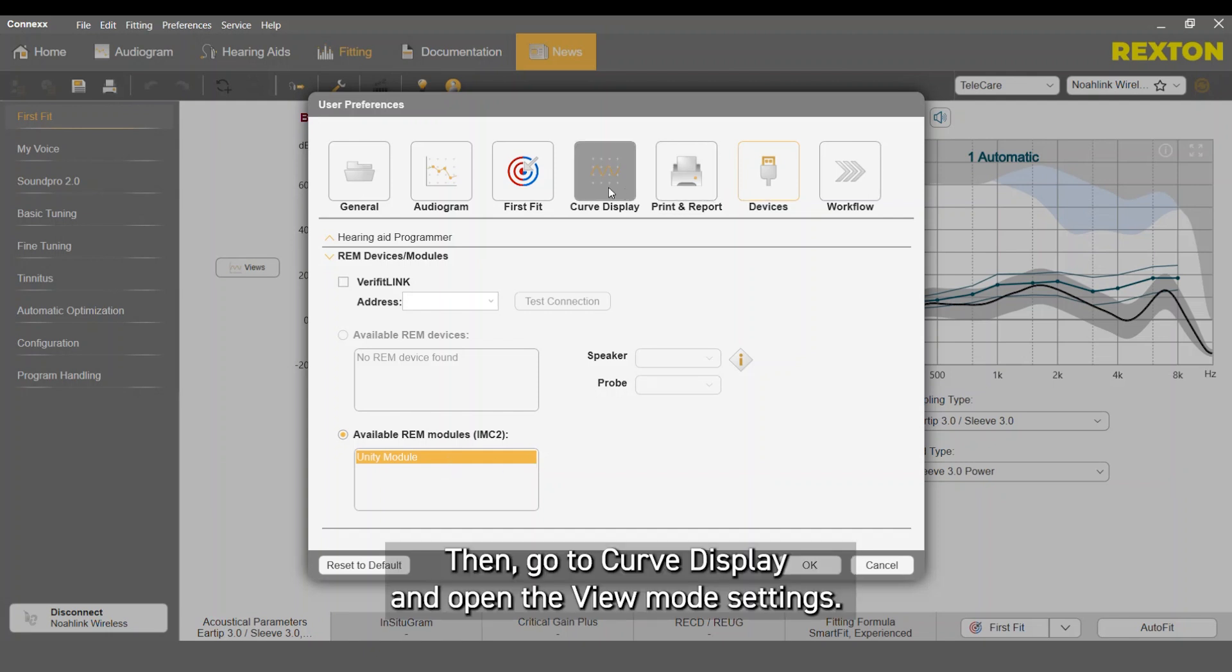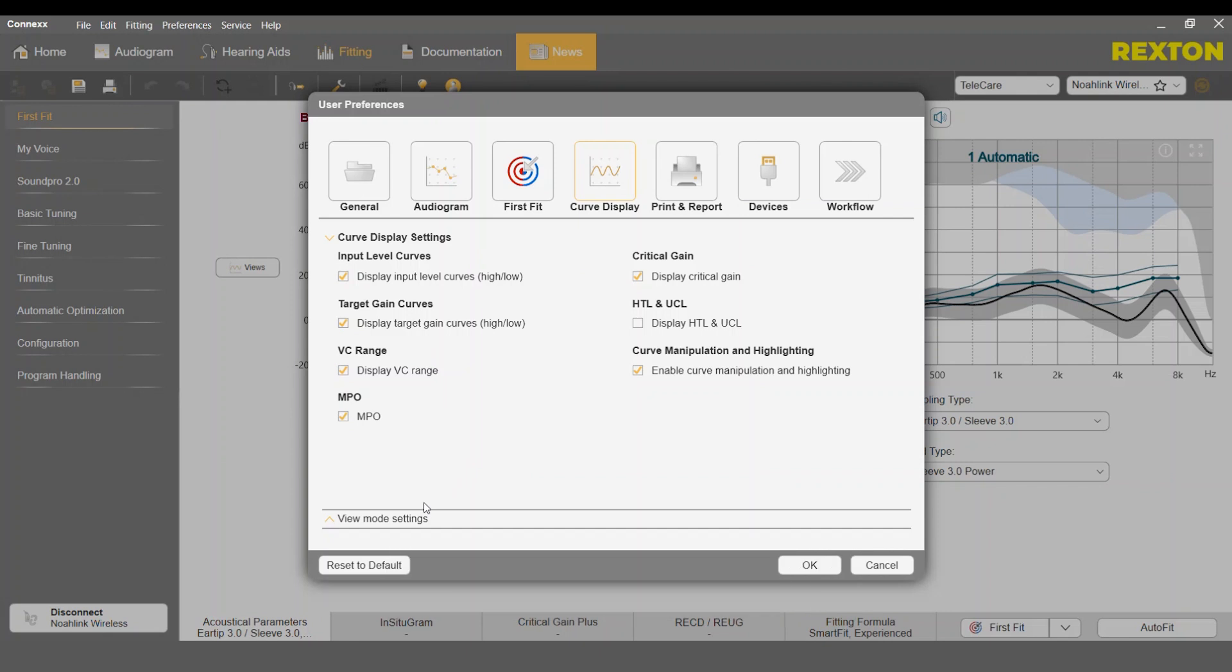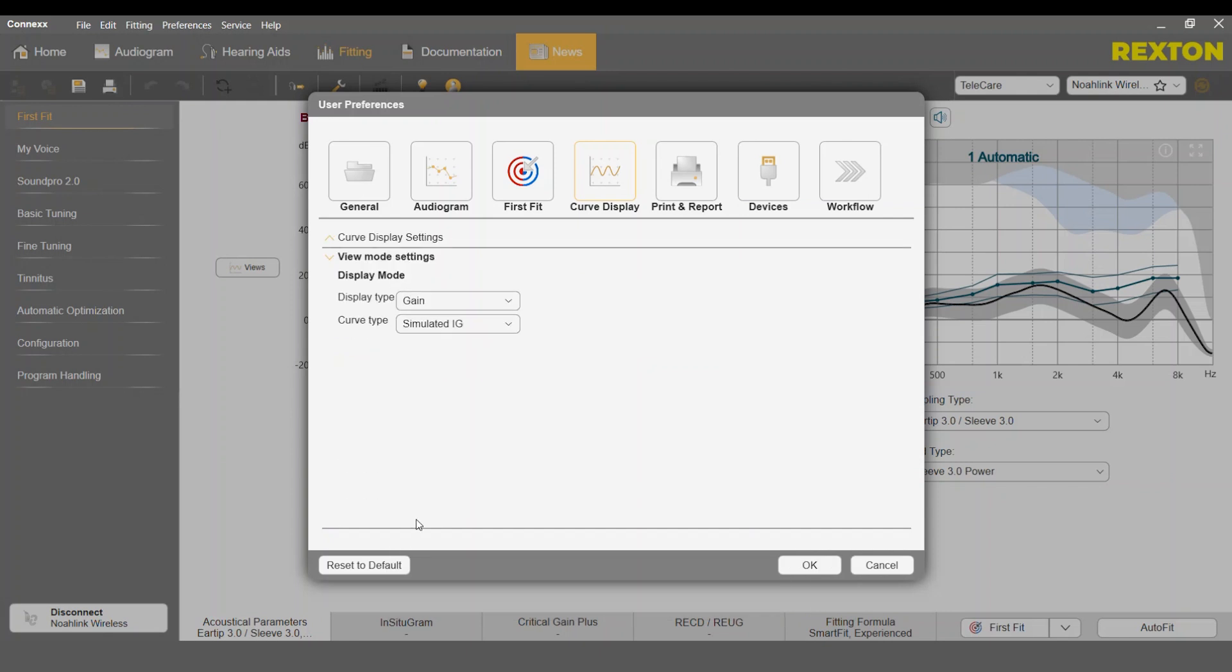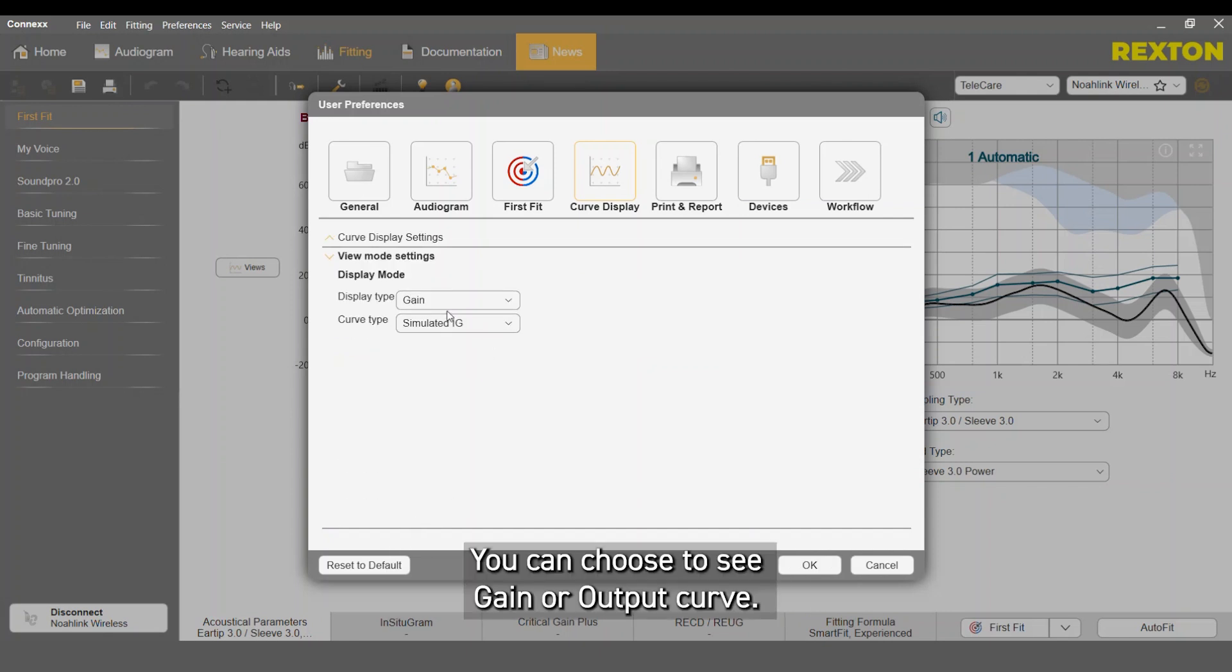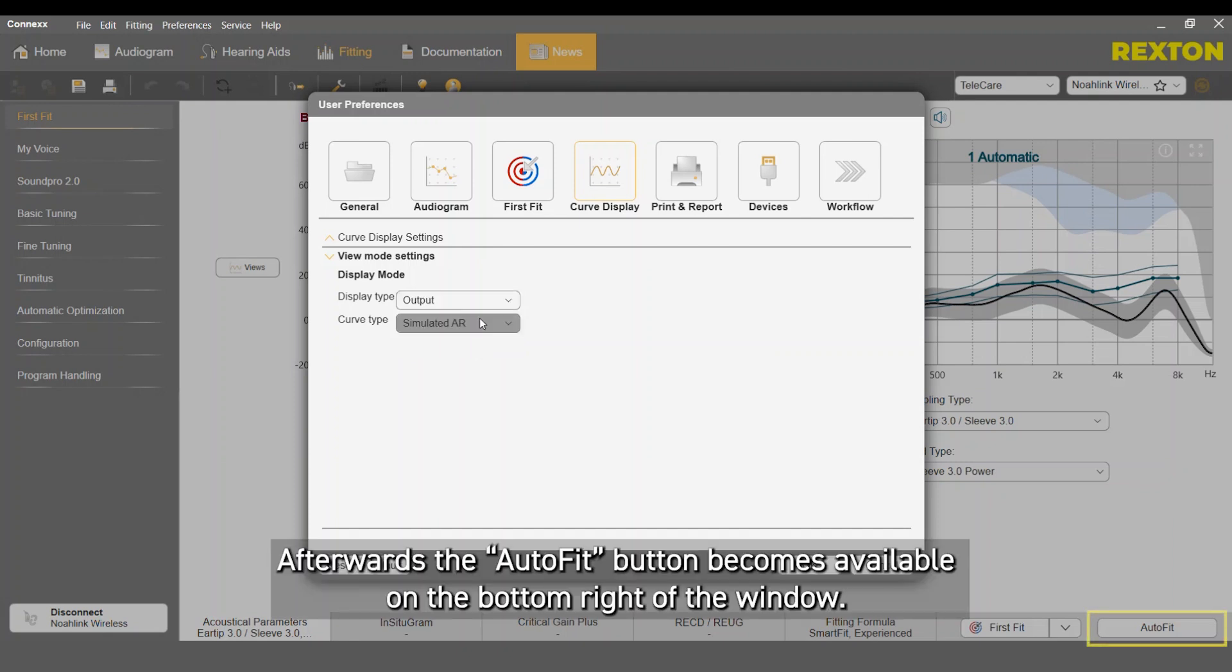Then go to Curve Display and open the View Mode settings. You can choose to see Gain or Output Curve. Afterwards, the AutoFit button becomes available on the bottom right of the window.